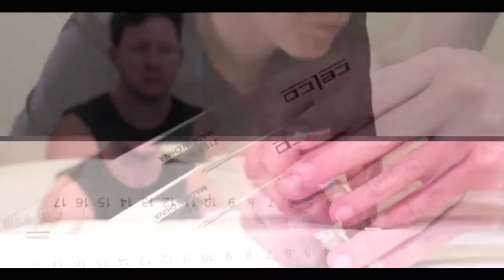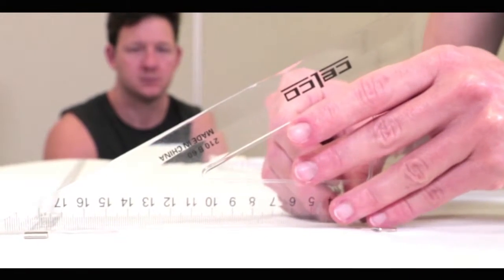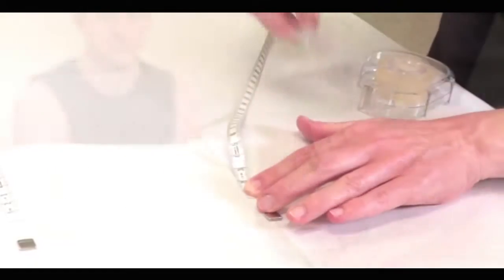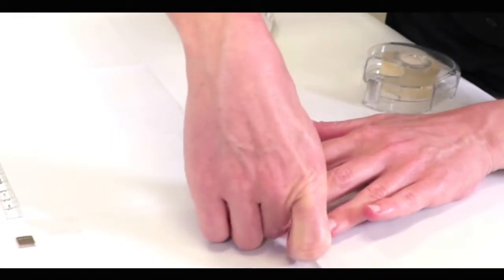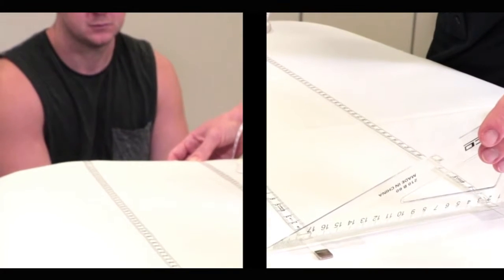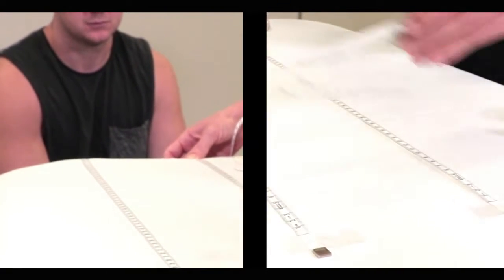Use the tape measures in a similar way to the measuring board to position and mark the arm, as we have described earlier. Or you could do similar with laminated graph paper as an example. Measure the unaffected arm in the same way.